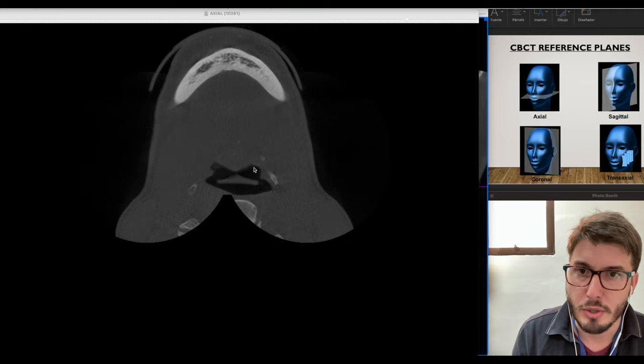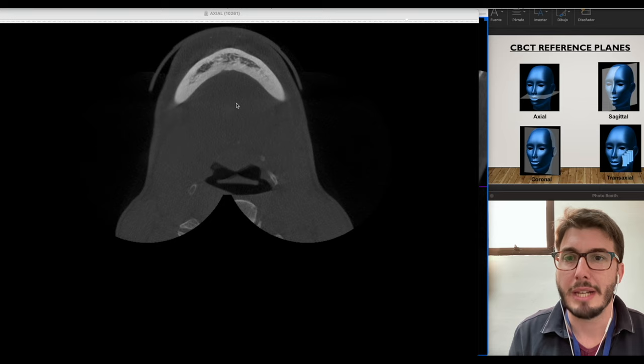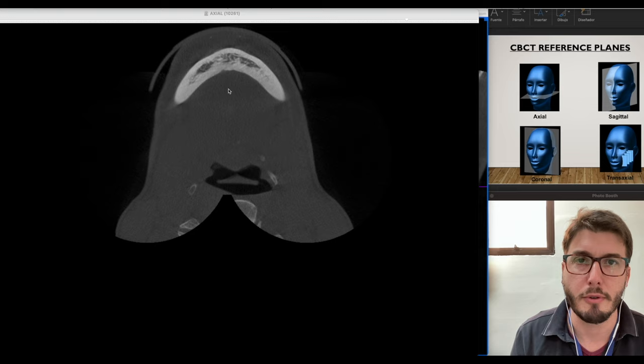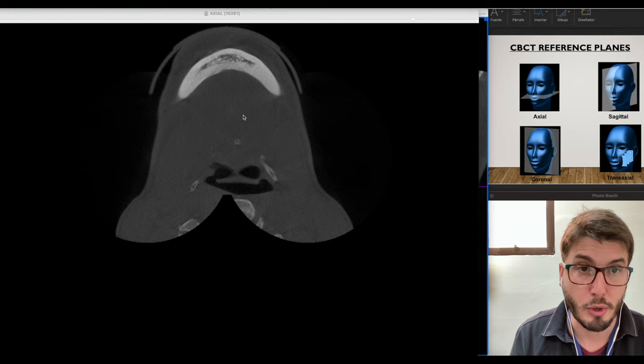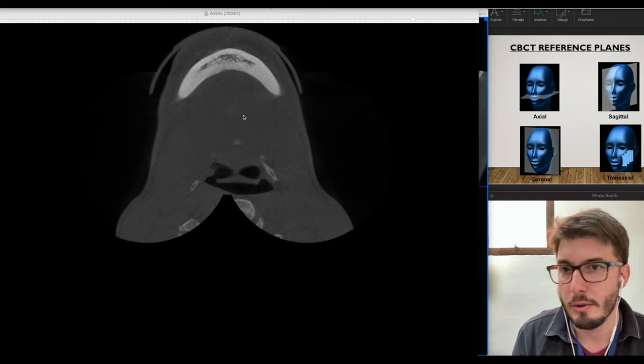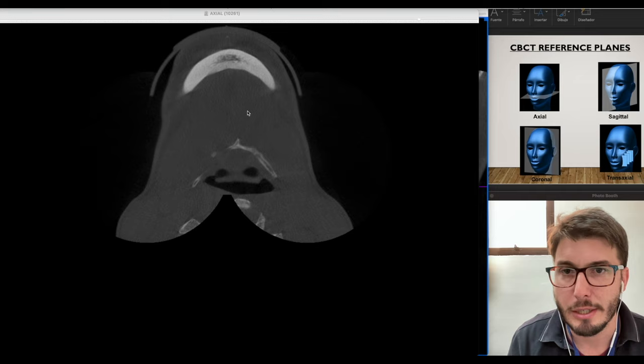Let's start with the mandible. I'm going to go from bottom to top of this scan, just like in the other video. If you don't remember how to navigate through CBCT, please go back to my CBCT tutorial — I'll add the link in the top right of this screen. So let's start with the base of the mandible; I have the cortical of the base of the mandible here.